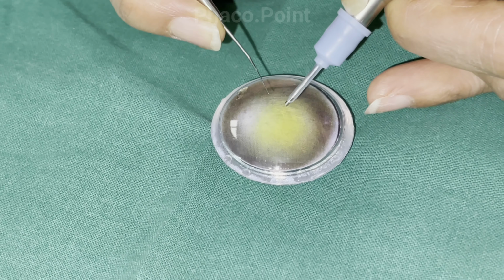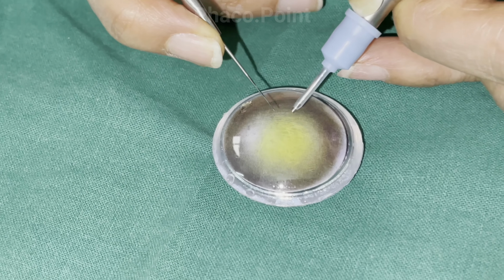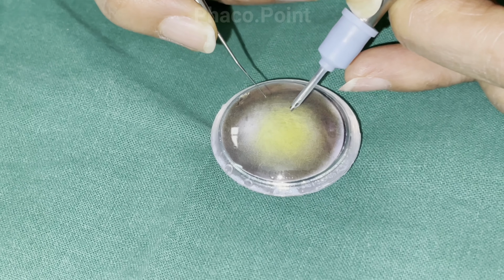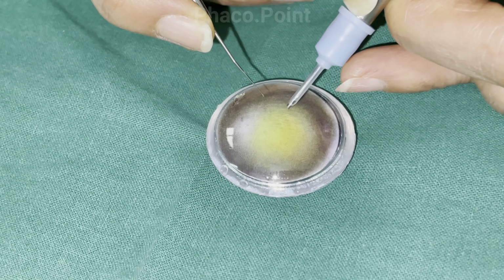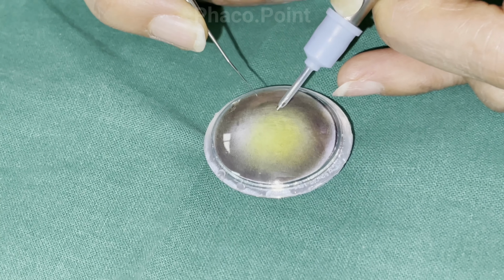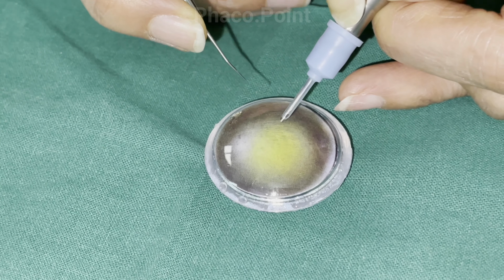So now you've got a fragment here. What would be your foot pedal movements to removing the fragment? So I go close to the fragment, halfway down its depth. I'm still in foot pedal 1. I go close to the fragment. I now move to foot pedal 2. But I do not bury into the fragment in foot pedal 2. From there, I now move to foot pedal 3.